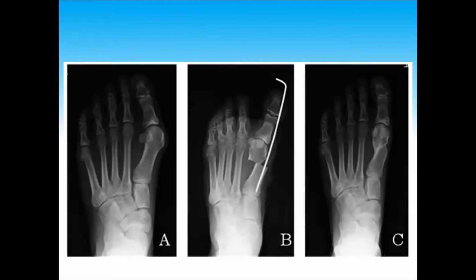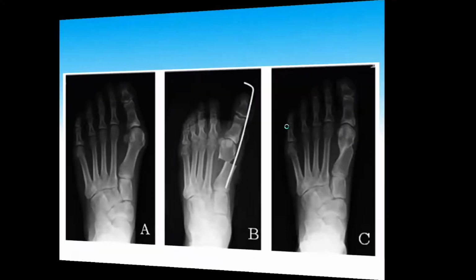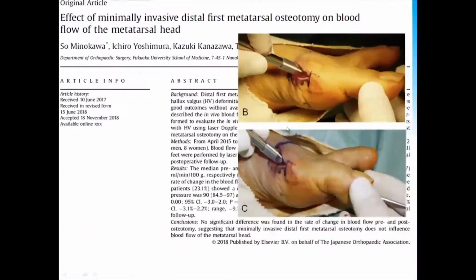And this was a 4 to 6 week recovery, but when they took every step postoperatively, the pin would move, get draining, and could create some pain and swelling issues because it's unstable, and also the pin is prominent. So there have even been reports of osteomyelitis after this kind of open pinning procedure.